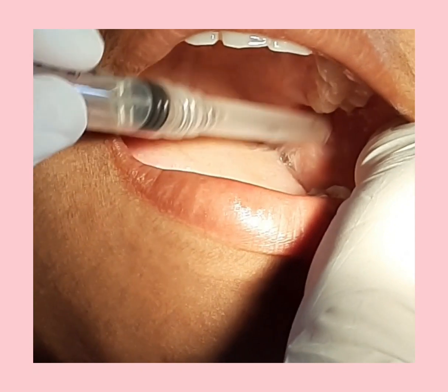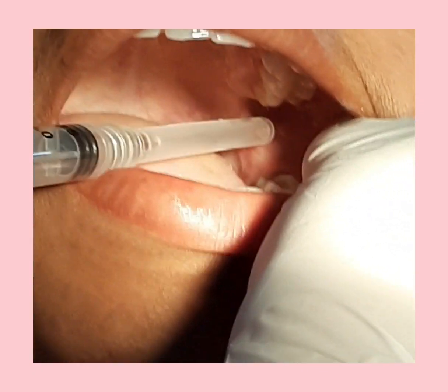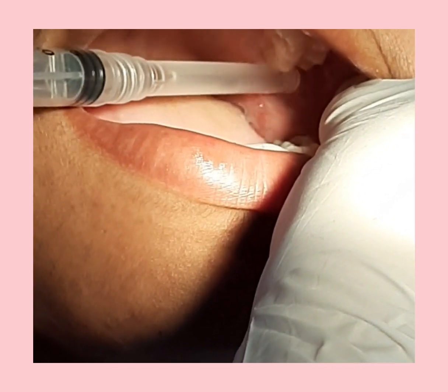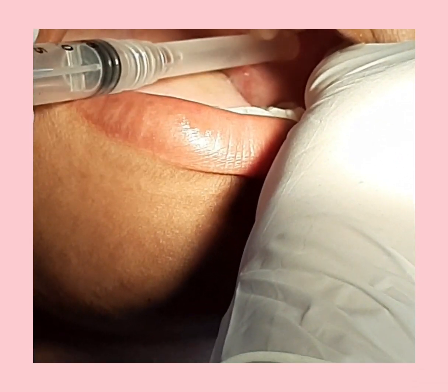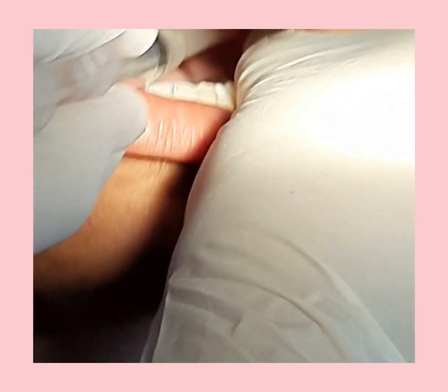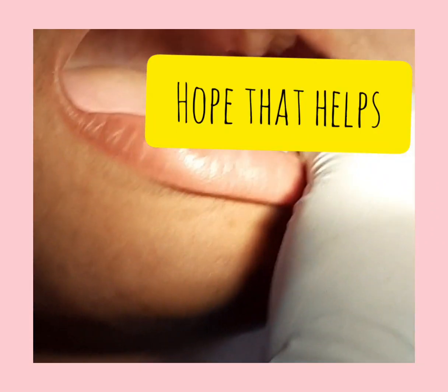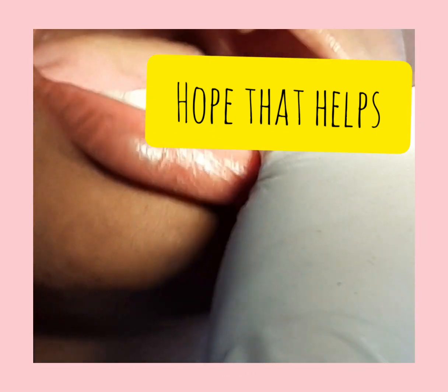Just keep in mind: take your needle from the angle of the mouth, beside the pterygo-mandibular raphé, and make sure that your needle is at the level of the thumb or bisecting it. And yeah, you are done — thank you!